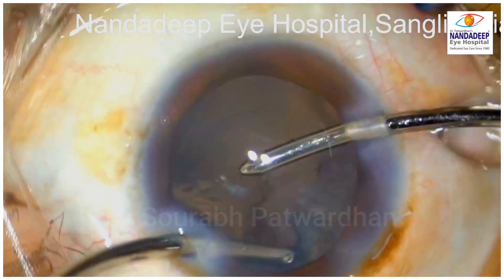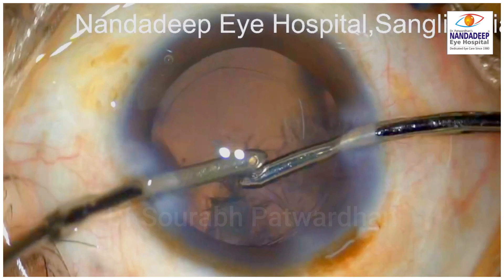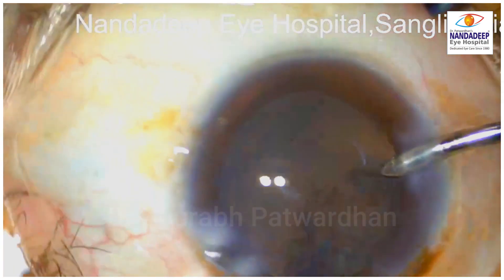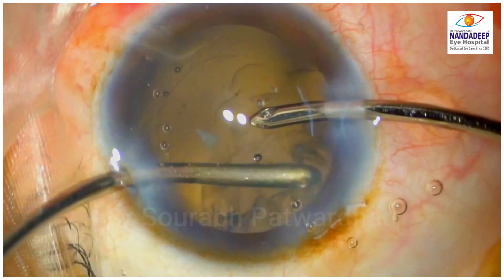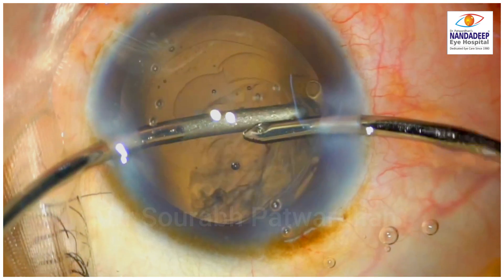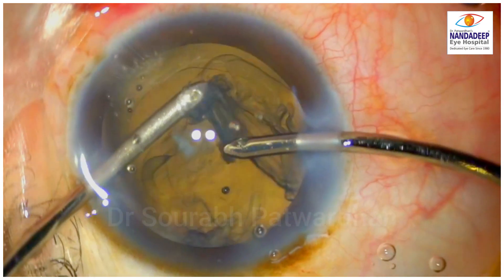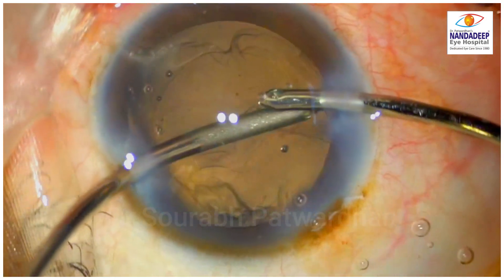So now, as the surgeon is a bit reluctant to pull this cortex and worried that the capsule tension ring will move and the bag will get further damage, the surgeon asks for my help and I will show you the way to remove it. Start pulling this cortex tangentially. You can see the CTR movement but don't be alarmed by that — a little bit of movement is not going to damage the bag.